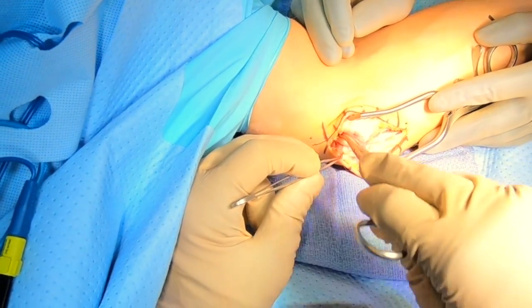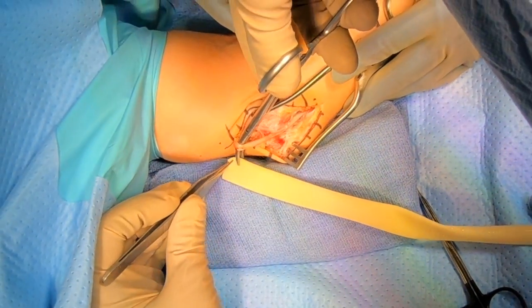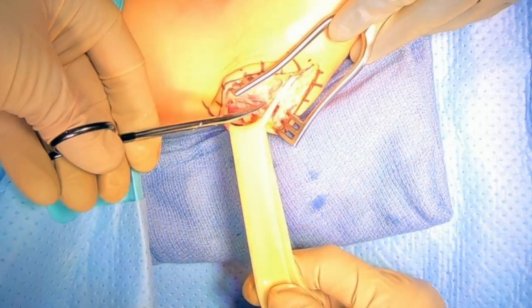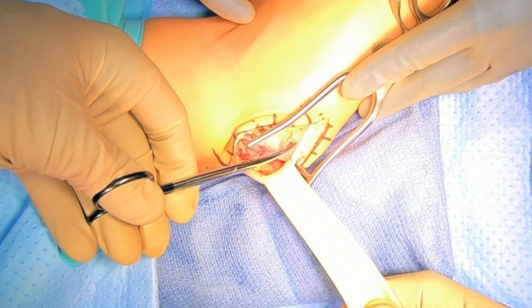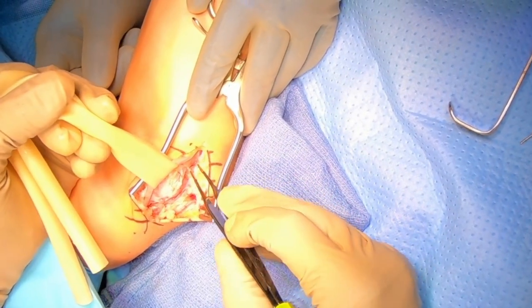We'll then use this clamp to pass what's called a Penrose drain. This is surgical tubing that is flexible to make sure that it doesn't injure the nerve. We'll pass this around the nerve and use this to manipulate the nerve to make sure we're not actually pulling on the nerve with any sharp instruments. You'll see me here carefully freeing the back side of the nerve, making sure that we can pull it out of harm's way.